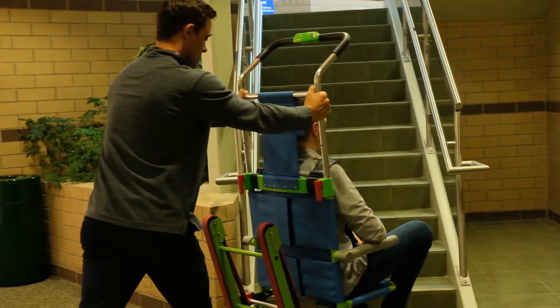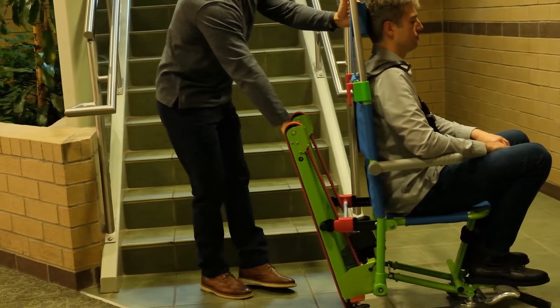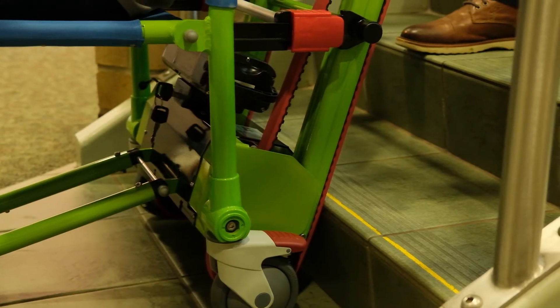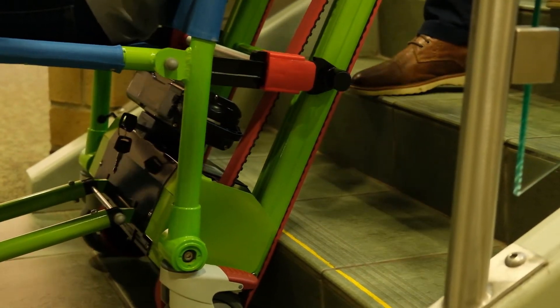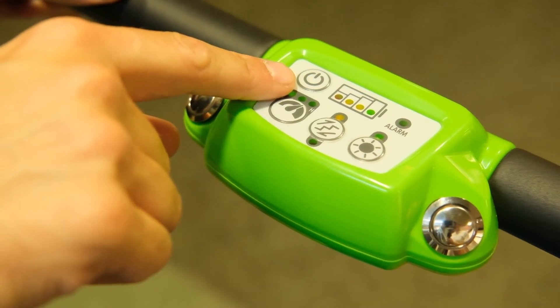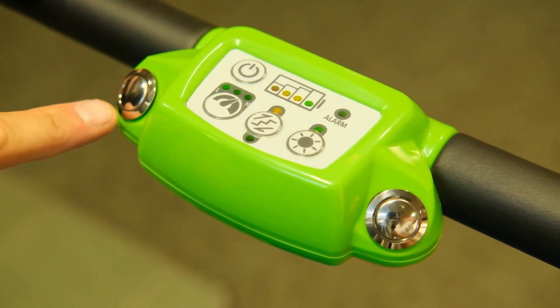Move the chair to the bottom of the stairwell with your hands in the pushing position on the outsides of the handle. Turn the chair to face away from the stairs and, with the operator on the stairs, tilt the chair backwards to lay the tracks on the bottom two stairs. Once you are ready to begin ascending the stairs, turn the power button on, press the direction button until it is set to ascend, and press and hold either of the motor buttons.